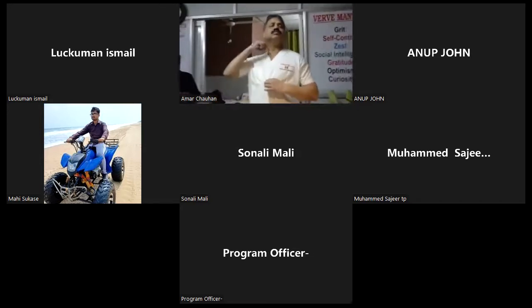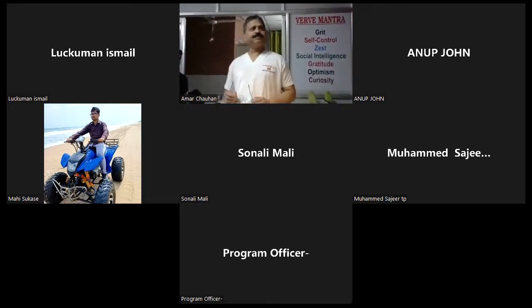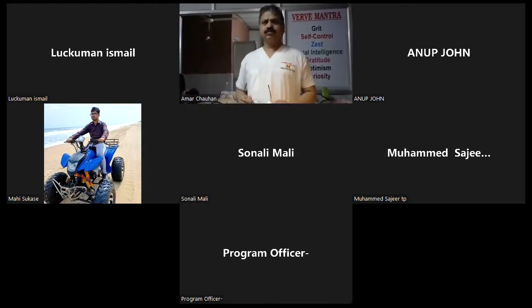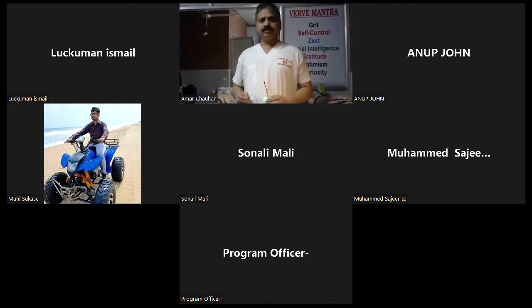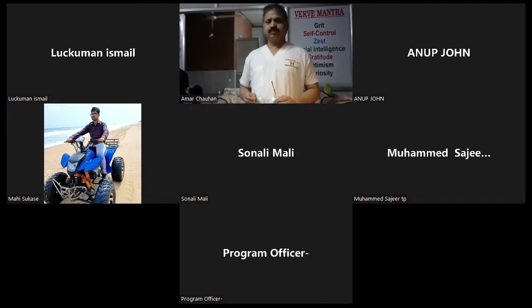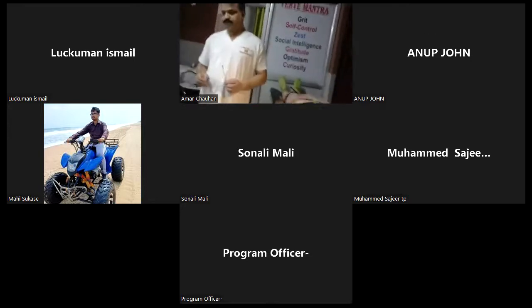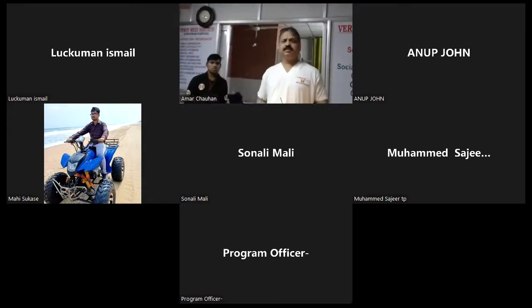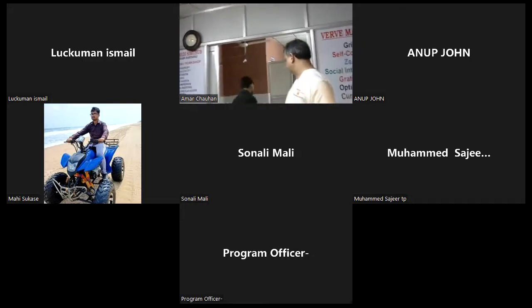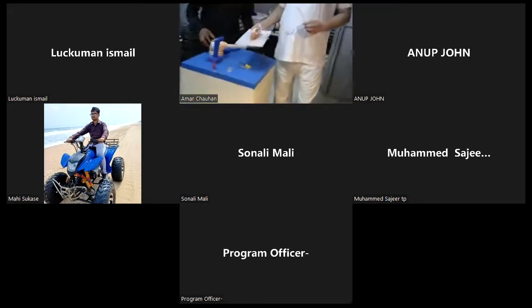Blood simulation or aspiration. Am I audible, doctor? Blood simulation on aspiration. Yes, you see now how you have seen aspiration of blood. I have one with multiple punctures. Okay, that is fine. Which is mounted on a stand. Yes, the mount stand is there. Which mannequin should I show? We'll show it. This is the mounted mannequin.